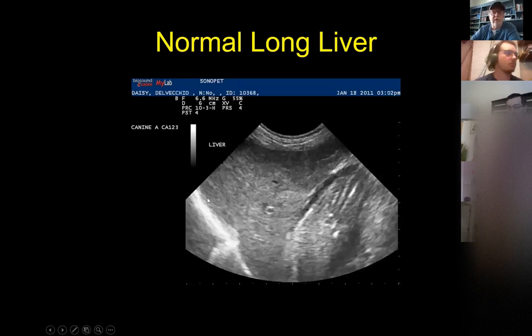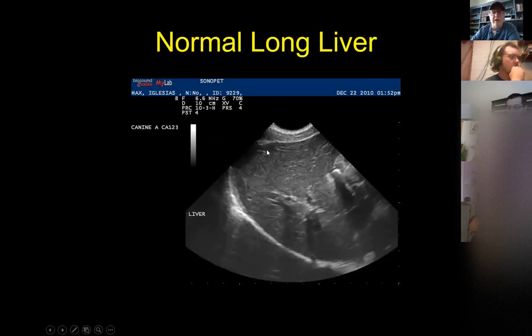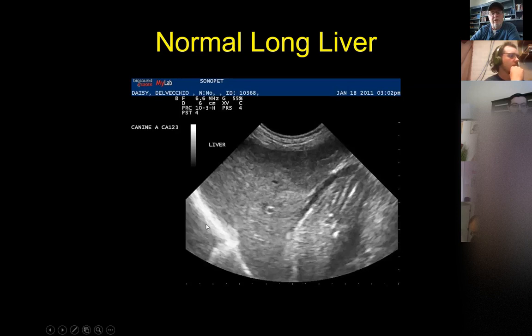Okay, here's another section of liver. Here's the diaphragmatic margin. See how it looks like there's liver over here? Do you think that's real? It's probably not real. That's going to be the mirror image artifact. Let's see if I saw it back here too. Not really. So here it looks like there's liver over here, but we know that's probably mirror image artifact. So here's a hunk of liver right in here, and here is the stomach next to it. We can actually see rugal folds inside the stomach right next to the liver.